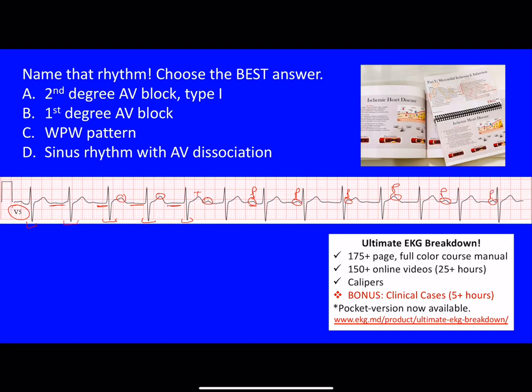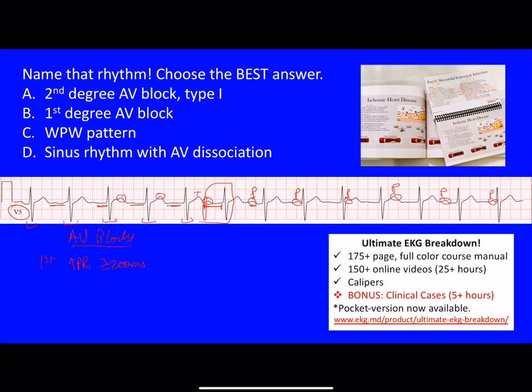Let's look at the answer choices. There are four AV blocks we should be aware of. First degree AV block involves an increase in the PR interval — in adults, that means greater than or equal to 200 milliseconds. The normal PR interval is between 120 and 200 milliseconds, or three to five small boxes. With first degree AV block, there are no dropped beats — you have constant prolongation of the PR interval. If the same complex repeated consistently, that would be first degree AV block, which we don't have here, so B is certainly wrong.